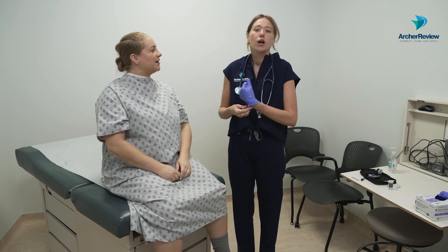Feeling queasy at all? I'm okay. If they're in a hospital bed, as always, we're going to want to raise the top rails, put the bed in the lowest position with the call light within reach, and then make sure that you document that blood sugar check — what the blood sugar was and where you tested. And that's it for how to perform a glucometer check. You're ready now to go poke your patients and check those blood sugars. Join us back for our next clinical skill video where we will cover more point-of-care testing.